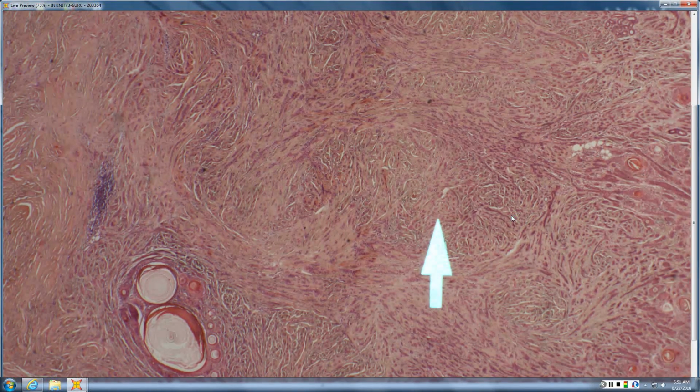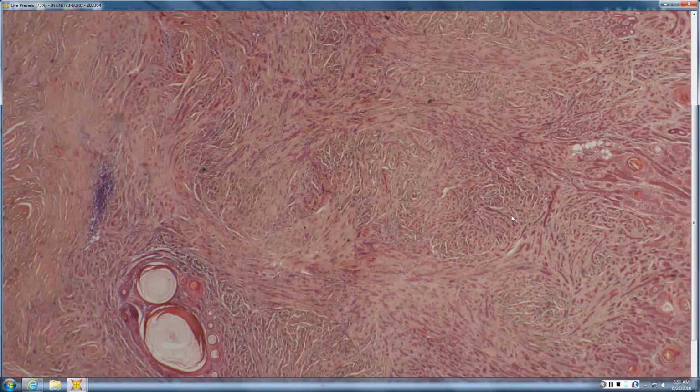And then one of the things that points you towards microcystic adnexal carcinoma here is that it's a biphasic tumor. Up top, there's what appears to be little keratin-forming cysts, almost like a trichoepithelioma. And some of these are sweat ducts as well, so there are little syringomatous proliferations, but it's kind of mixed.